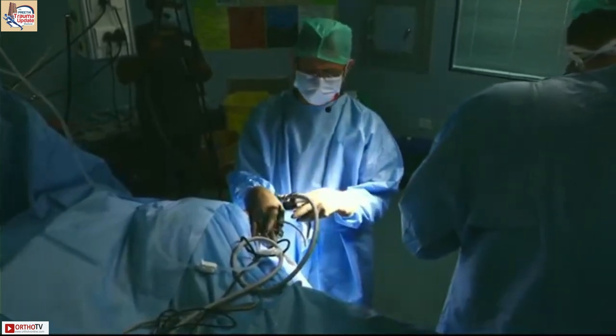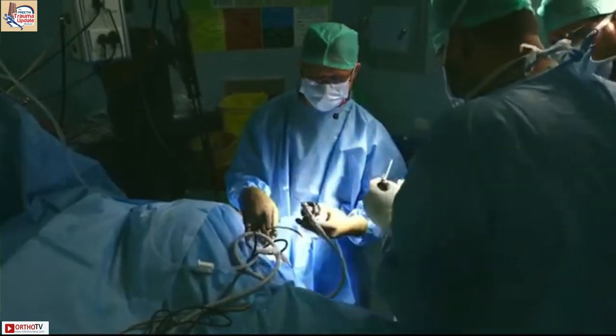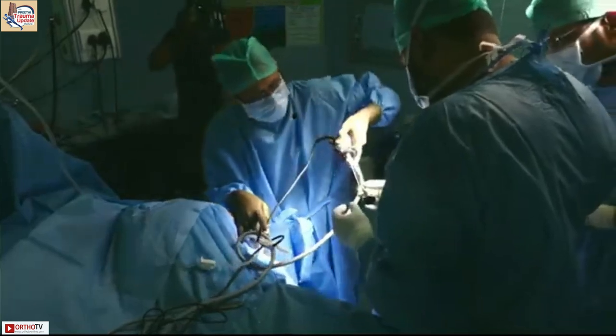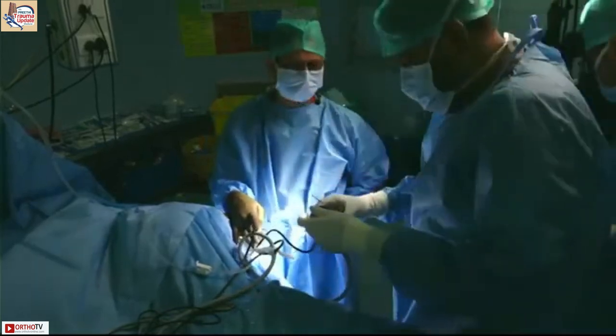So your Karl Storz, what scope sizes do you have? We have 1.9, 2.4, 2.7. Arthrex, is the length the same? Length is same. Arthrex is 3 mm. No, bigger. Okay, let's put this one on.